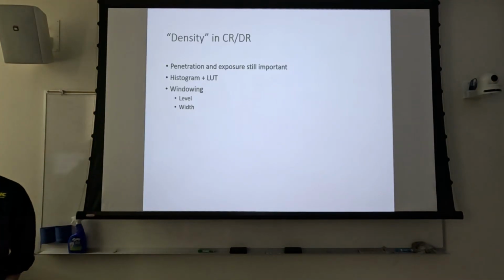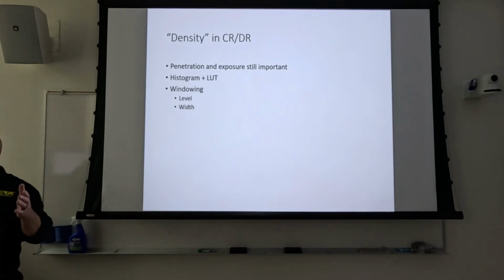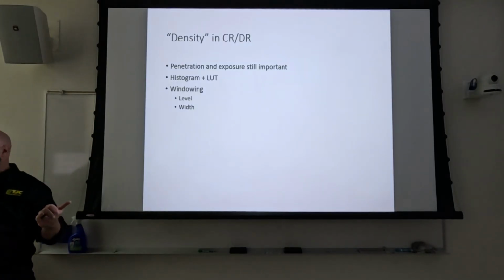But every other time I've had a new machine put in, the applications tech would come along and they'd have maybe, for every exam, 4 different x-rays on the screen. They'd say, okay, which one do you like best? And what they do is they take usually 1 or 2 radiologists, maybe a super user or whatever, and possibly a technologist.